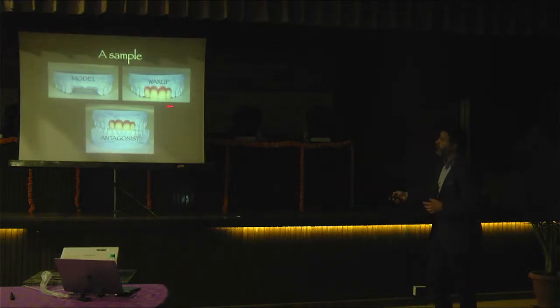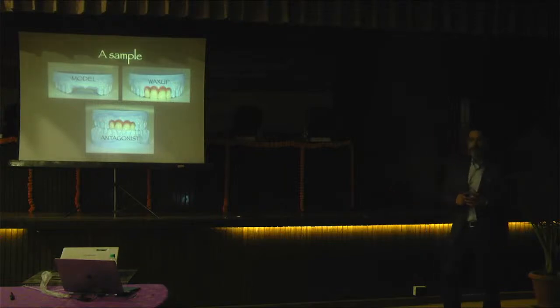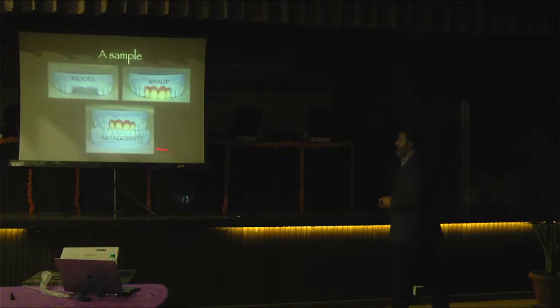So we should figure out the final point of the prosthodontics that we are looking for. So we create a wax-up model, and then we scan again for the wax-up model. And at the end, we have the antagonist jaw, and after it, we create a guide and place the implants like Turkish or Indian soldiers, okay?